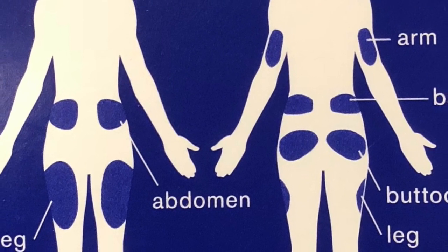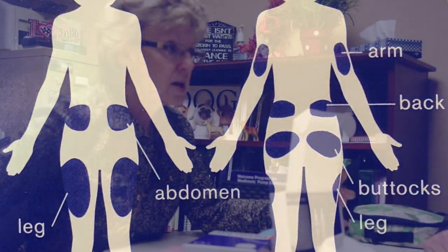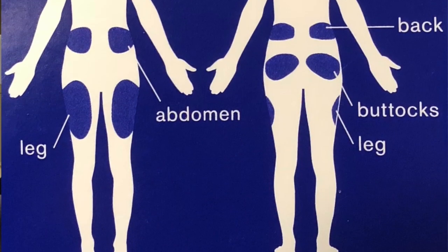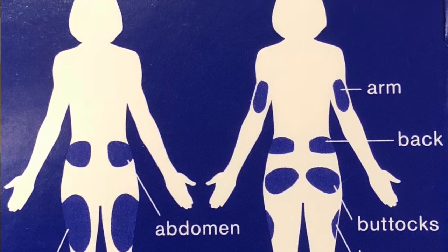and your upper outer thighs. Okay. Those are the places. And you will need to move it around. You can't just say, oh, I love it on the back of my arms and just have it there. Just like rotating your shots. Yeah. Now, you have to rotate these. You have to move them around every time you use it.